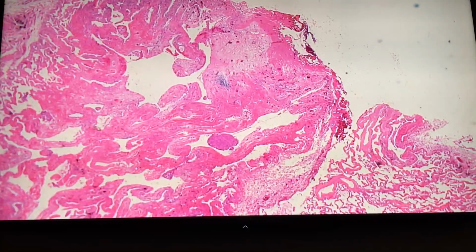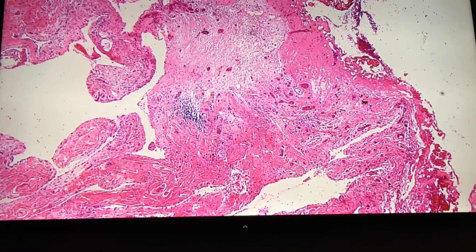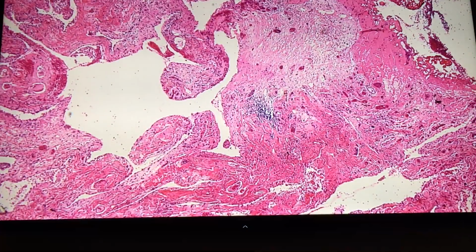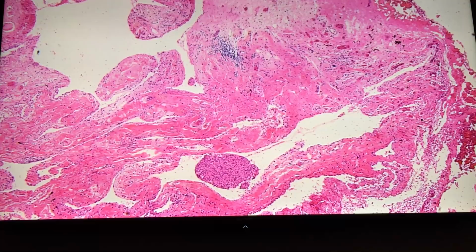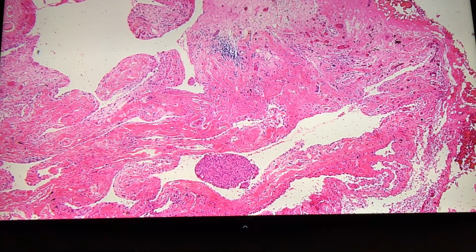Yeah, see that area. So that lung is really emphysematous, and why it's hard to tell that it's emphysema is usually you don't get fibrosis in emphysema. You're not used to seeing big holes in fibrotic lung, but that's actually what this is. This is emphysematous lung with ropey alveolar septal fibrosis. So you've got the three components: ropey collagen, RB, and emphysema. Everything has to be together, and then you can call it smoking-related interstitial fibrosis. I don't need to know this patient is a smoker. I know from this triad. Okay. Next, Aaron.